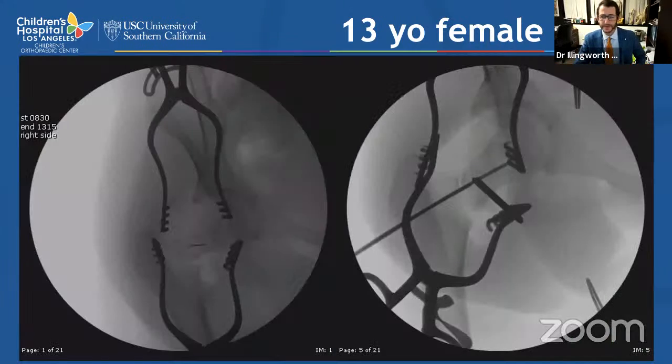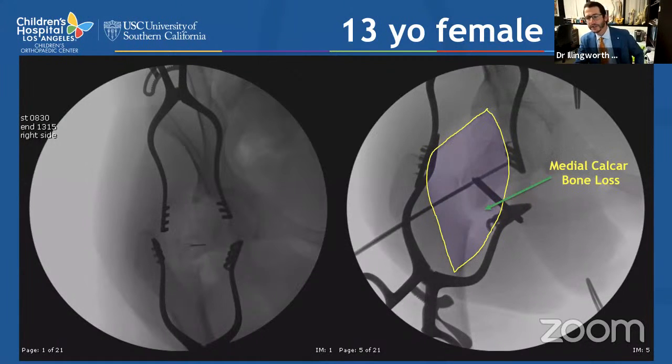Here are some intraoperative photographs of that particular patient. Over on the left side, this is with pulling traction. You can see that the ability to get this reduced in a closed fashion is, in my hands, not possible. And so she got a formal anterior open reduction. On the right side, if you make out the soft tissue shadows of that approach, you can really see that you get a nice view of that transcervical femoral neck fracture.